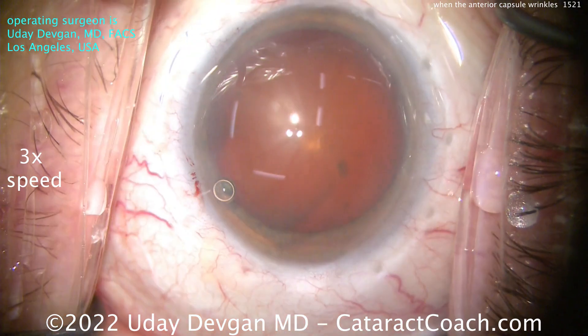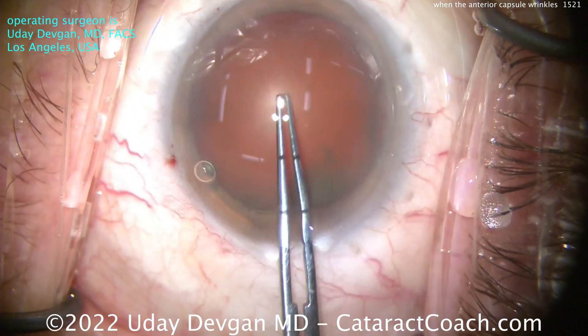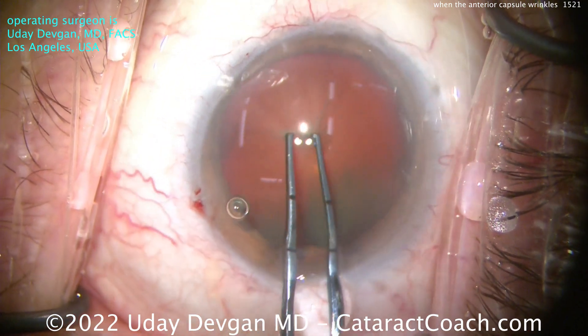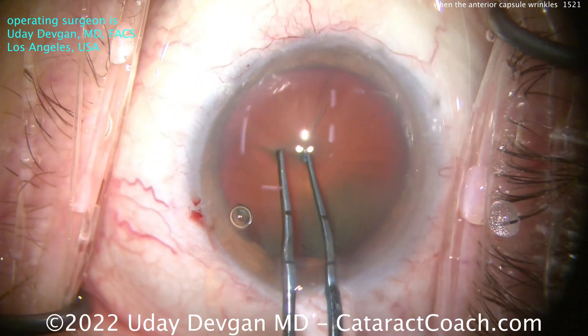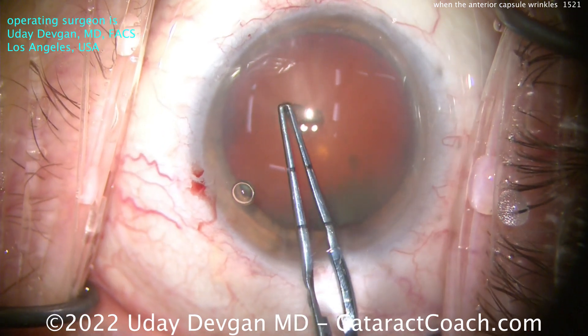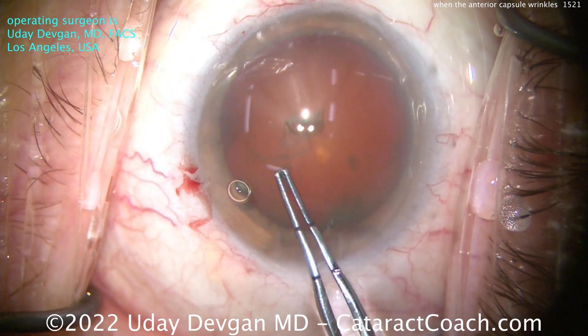In this case, you're not going to have that. We sped the video up. You can see here, starting the rhexis — and here's the key point: poke in, and it just wrinkles. See the radial wrinkles? It's hard to poke into the capsule. If the capsule was nice and taut, it would be a lot easier. So here we're able to finally start that rhexis.